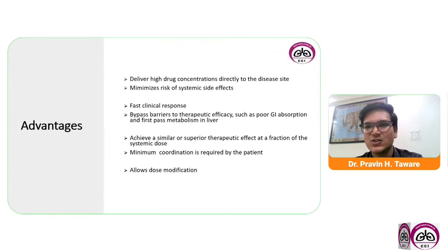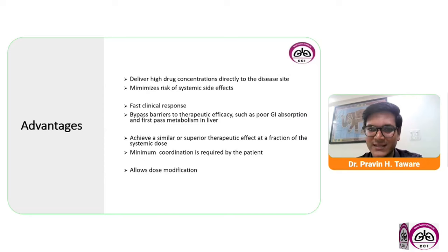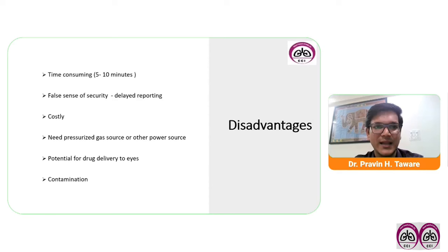So what are the advantages of nebulization therapy? You can deliver a high drug concentration directly to the disease site, it minimizes the risk of systemic side effects, and gives a fast clinical response. You can bypass barriers to therapeutic efficacy, achieve a similar or superior therapeutic effect at a lower systemic dose, and minimal coordination is required by the patient. And you can do dose modification and use multiple medications at the same time.